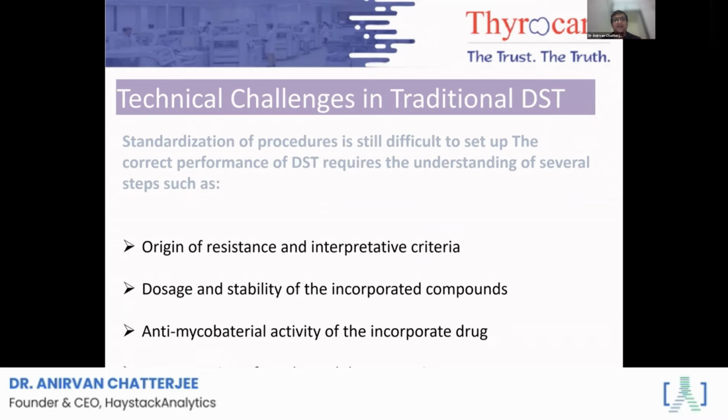That technical challenge is the origin of resistance, and the criteria that we use to make that choice of drug resistance and make the choice of therapy thereof. The interpretation of results and data reporting must be standardized to an extent where, in a country like India, where there are 30 lakh patients, they can all access decisions in the best possible format at the earliest point of time.